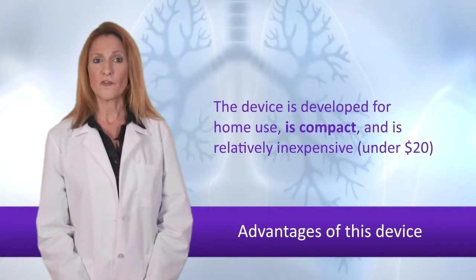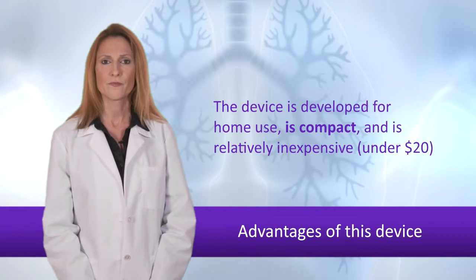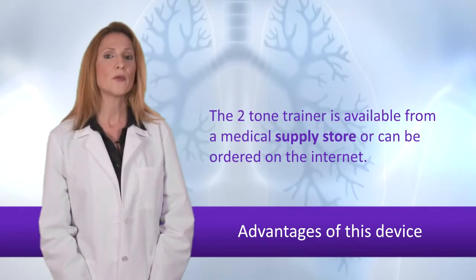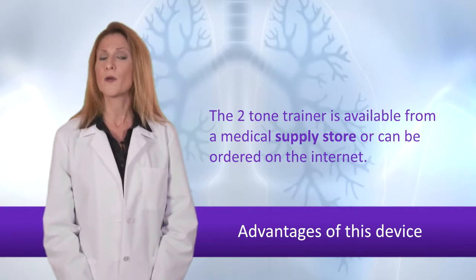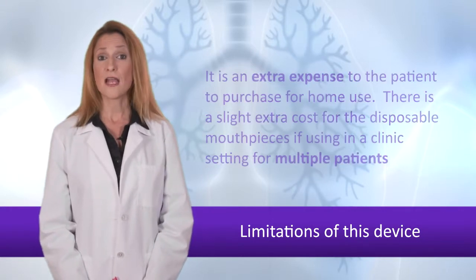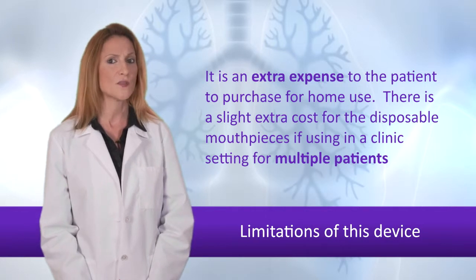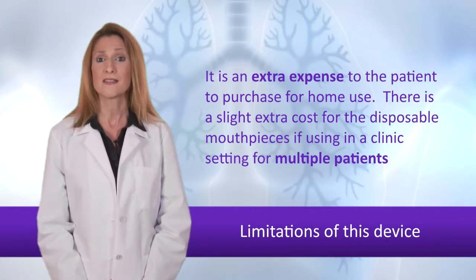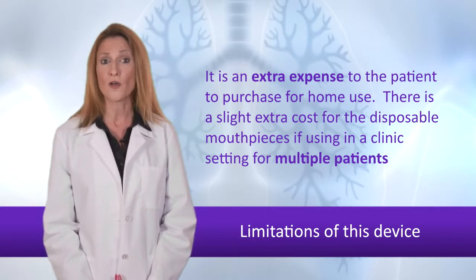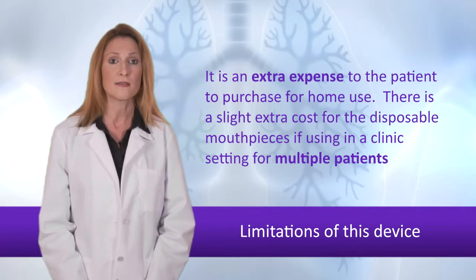The device is developed for home use, is compact, and is relatively inexpensive, under $20. The ToneTrainer is available from a medical supply store or can be ordered on the internet. It does not require a prescription. Limitations of this device. It is an extra expense to the patient to purchase for home use. There is a slight extra cost for the disposable mouthpieces if using in a clinic setting for multiple patients. If the patient was using a holding chamber with a flow signal or whistle, it would likely accomplish the same thing without the extra expense.